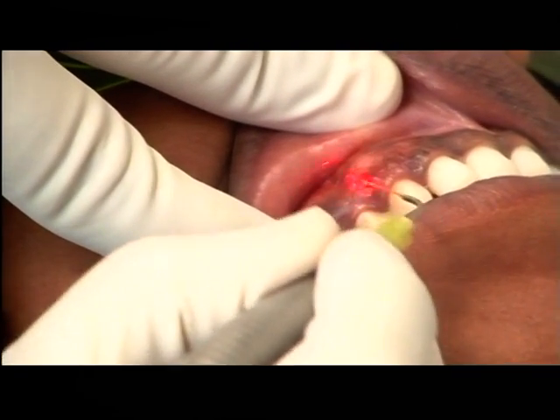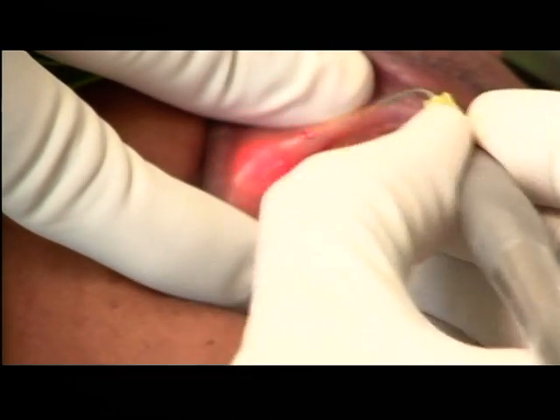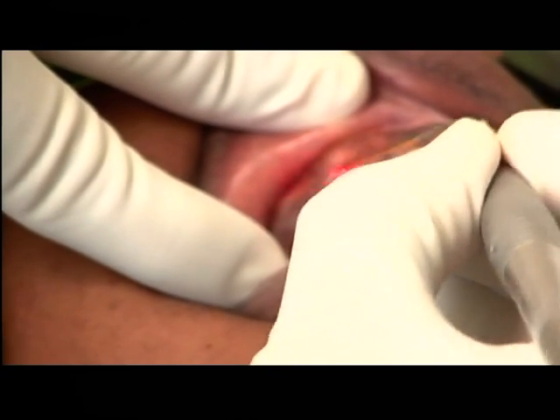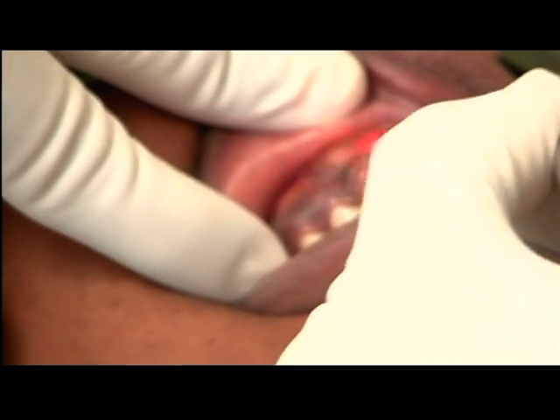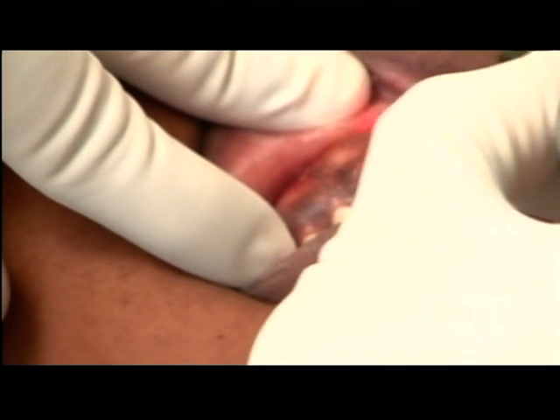It's totally bloodless, and you just make a sweeping motion. As you know, the epithelium will not be more than a few microns, so very easily you can just brush it off.